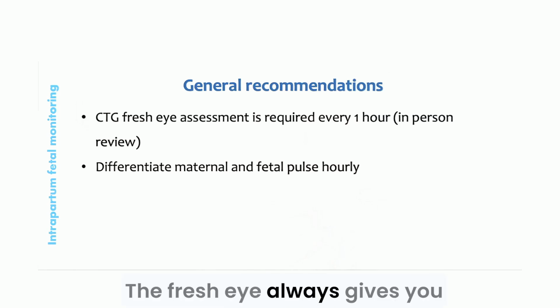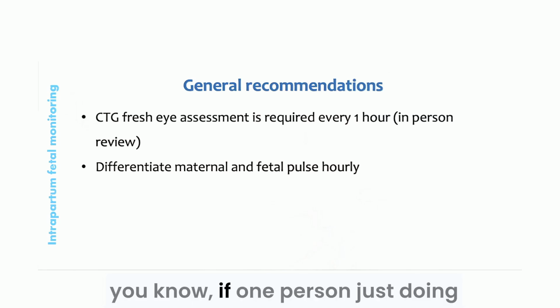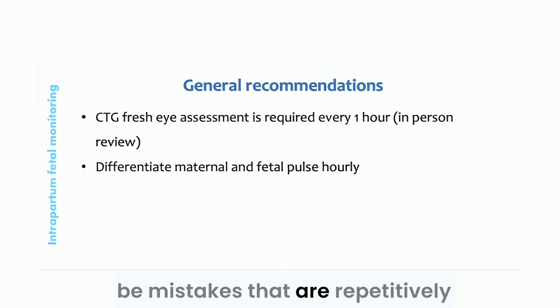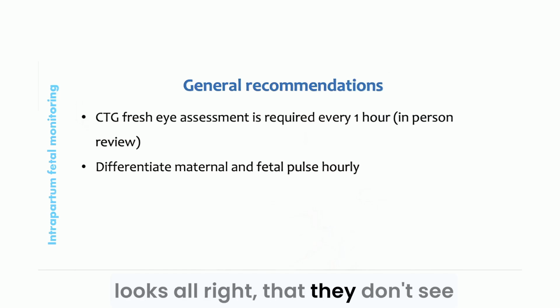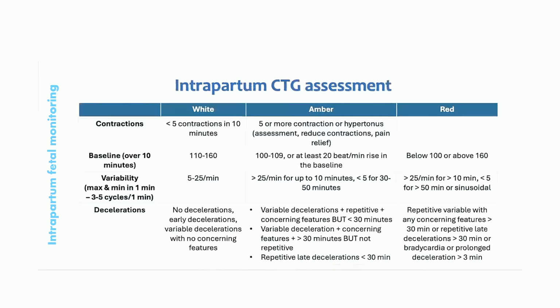The fresh eye always gives you another perspective, because if one person is doing the whole interpretation, there may be mistakes that are repetitively done, or maybe they just have something in mind that everything looks all right, but they don't see the full picture. So it's always good to get a fresh eye to be sure that everything looks all right.